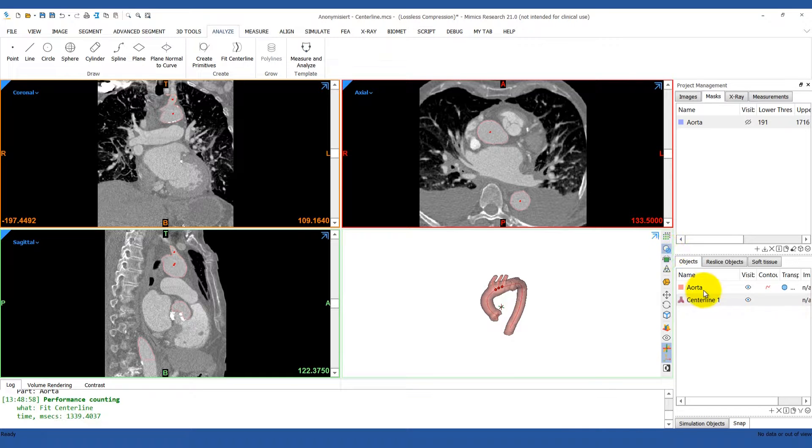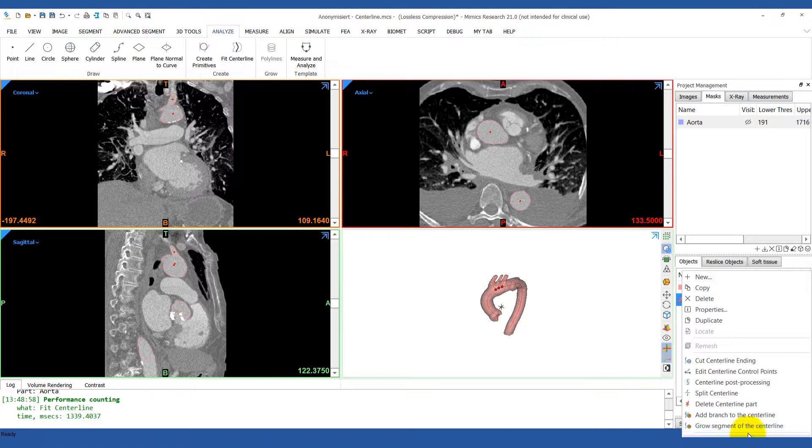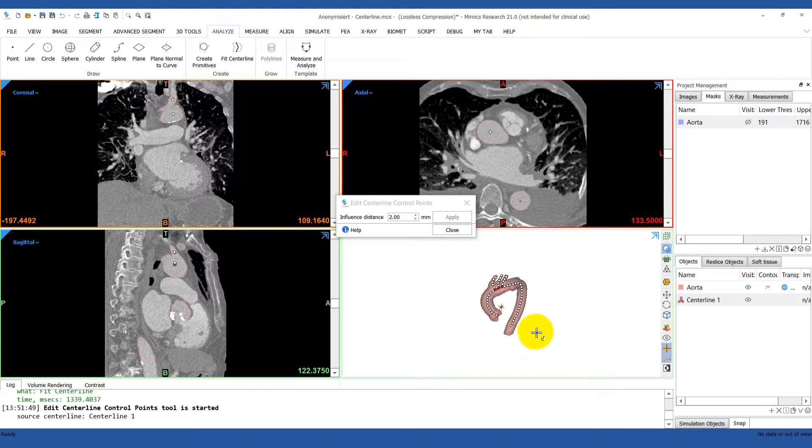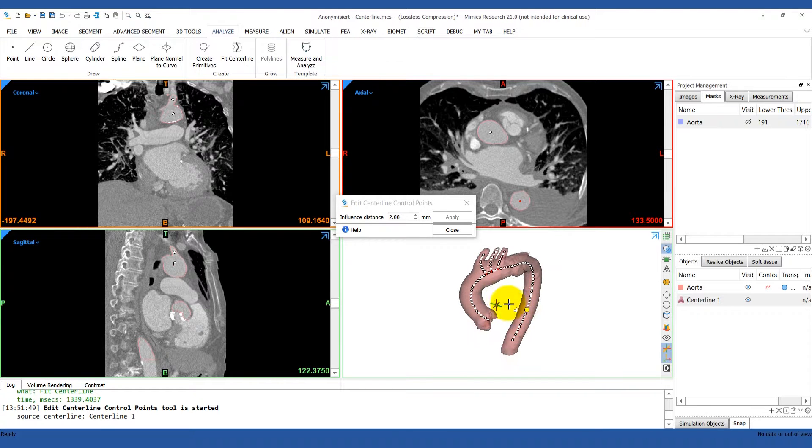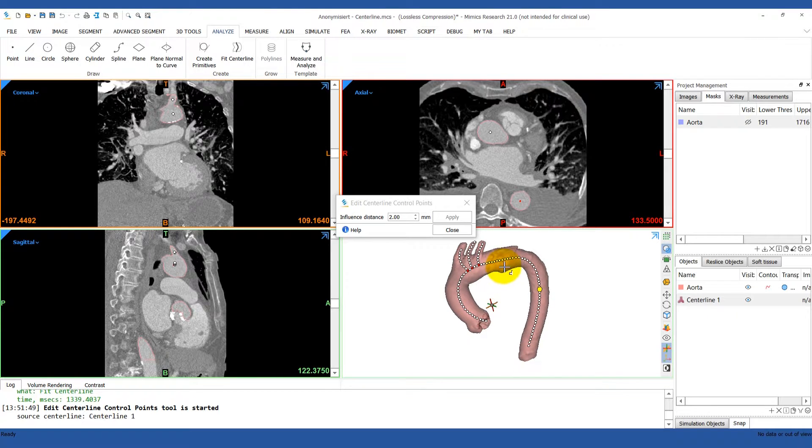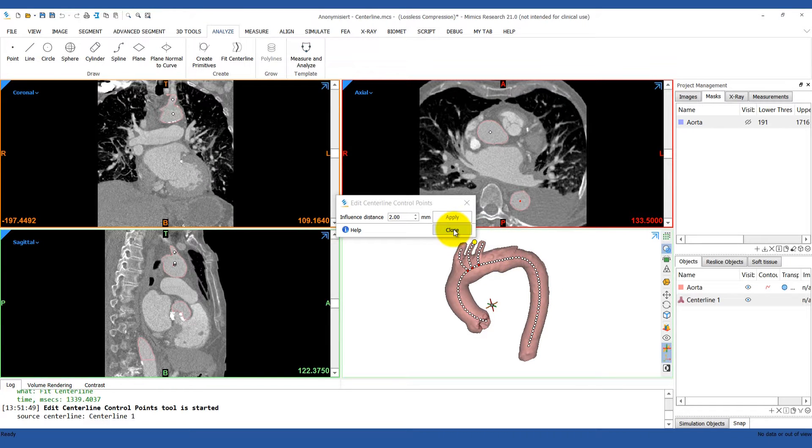You can also perform some advanced operations, which you can see by right-clicking on the centerline. For example, you can edit the centerline just by clicking on one of the points of the line and dragging it into a new location. But most of the time, you'll just want to keep them in their optimal position.